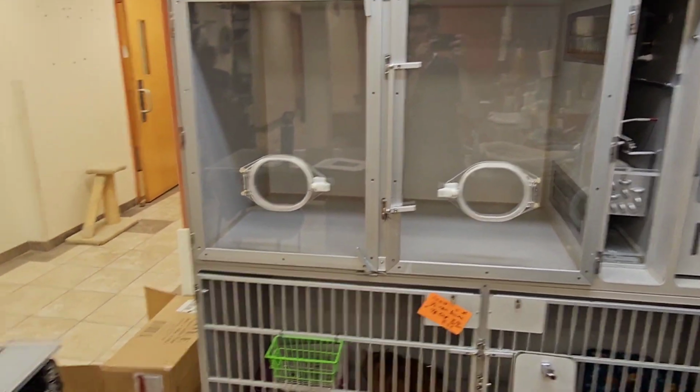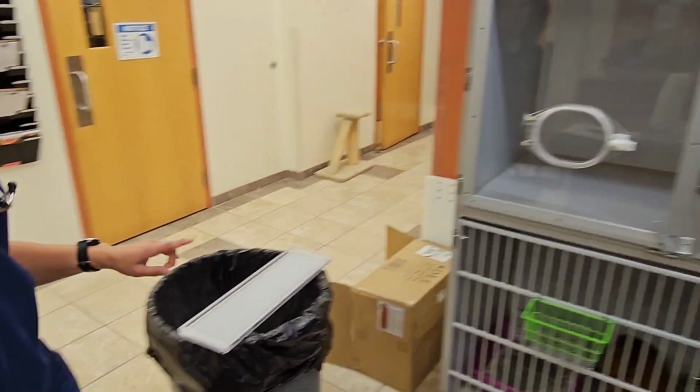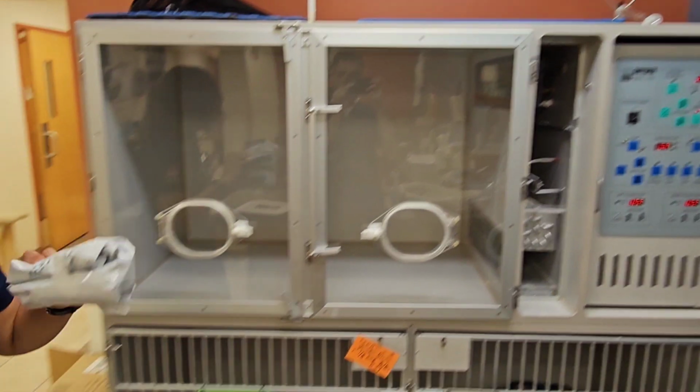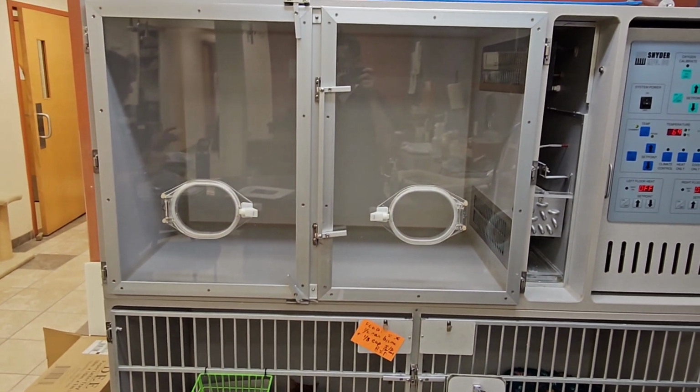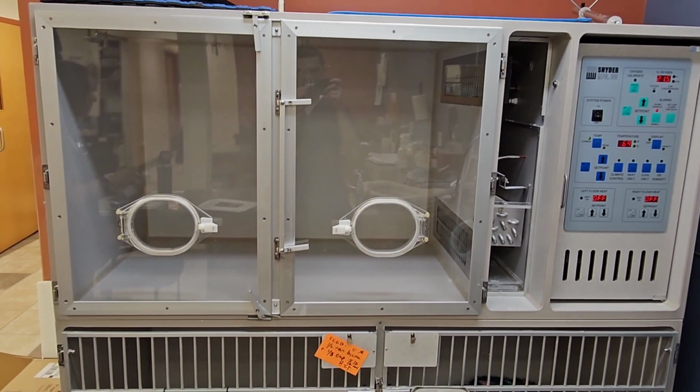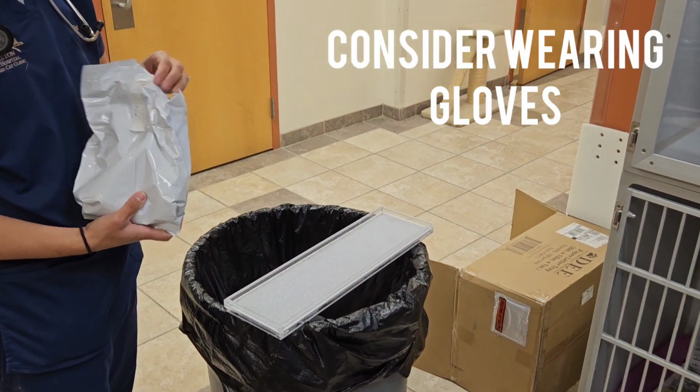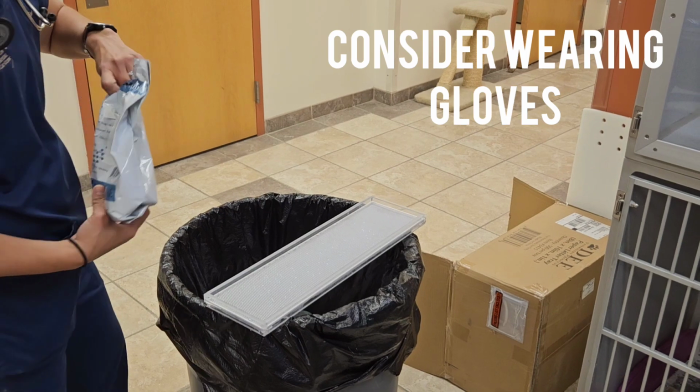And the best way is maybe to just put this right over the garbage so you don't make a mess. There's more soda lime up here. It may also be under the sink here in the clinic or under the counter. You can check those cabinets. Otherwise, you need to get more from the locked room in x-ray upstairs.